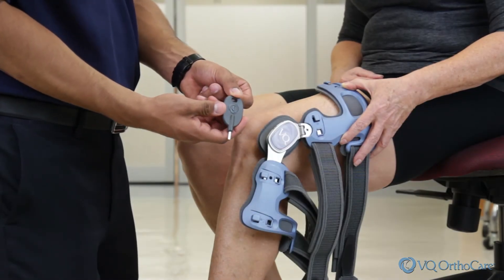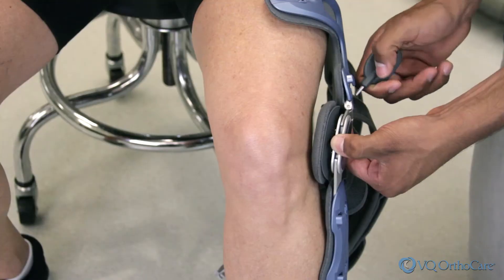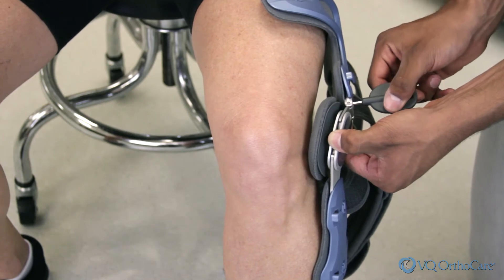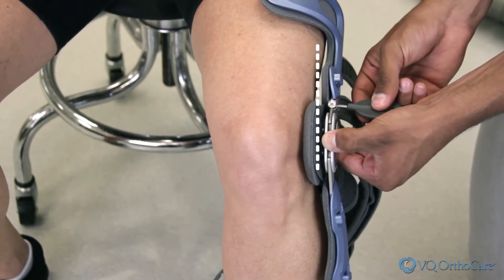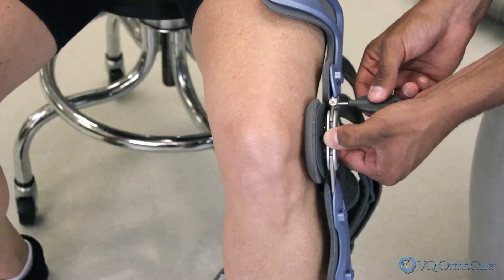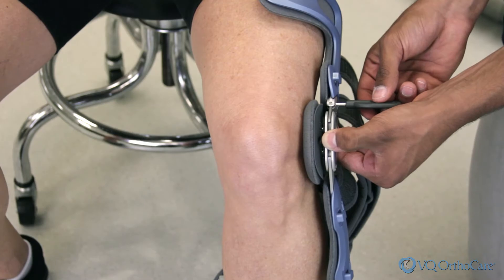On the initial fitting for the O-Active II off-the-shelf brace, the brace should first be adjusted to neutral. This is achieved by setting the correction angle at the Q hinge so the cuffs and hinge rest on the leg without gapping or pressure. Medial or lateral compartment correction will be adjusted later. If you have a custom O-Active II brace, the correction is preset and should not be set to neutral.